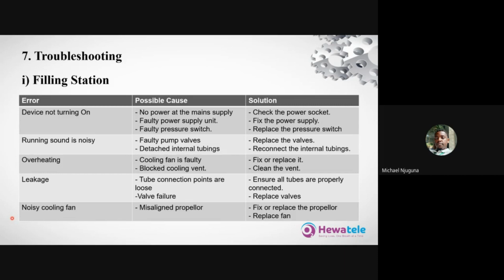Another possible cause of the device not turning on is the pressure switch, as we had seen earlier. If the pressure switch is faulty, then this could also cause the device not to turn on. So the solution to this is to replace the pressure switch.